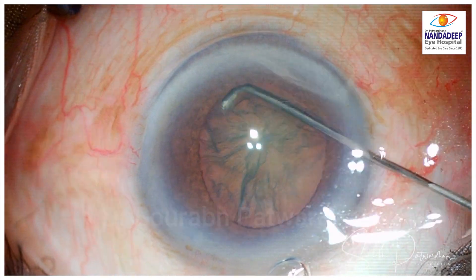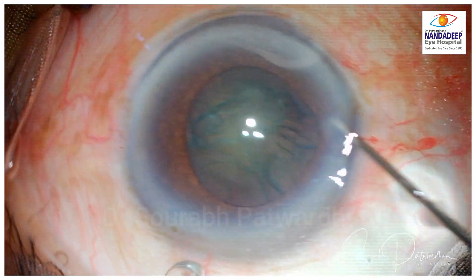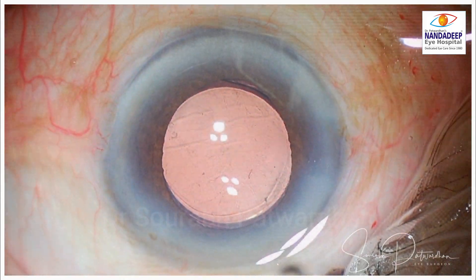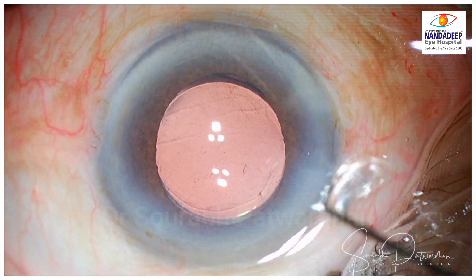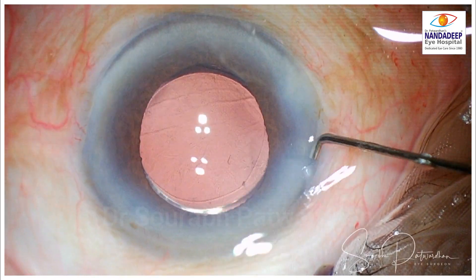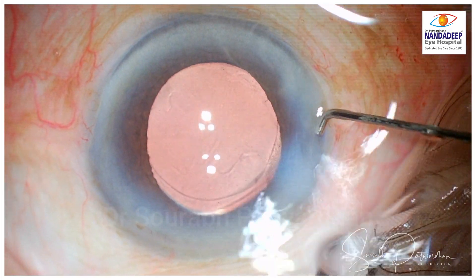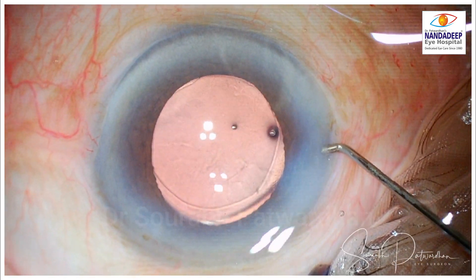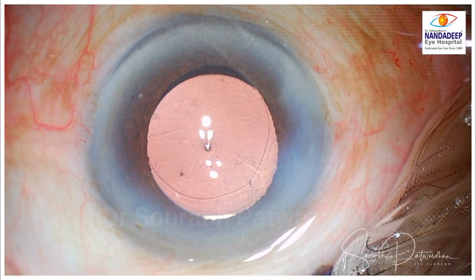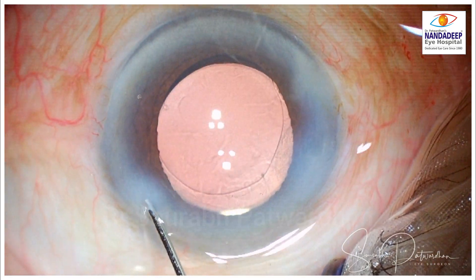With a slightly mid-dilated pupil, there it goes — a nice fluid wave and nice cortex-cleaving hydro dissection using this cannula. It also works well for hydration of the incisions at the end. Because of the small tip, you can rotate it easily without too many hand maneuvers, and hydrate the outer half of the incision on both sides. The same is true for the side port.